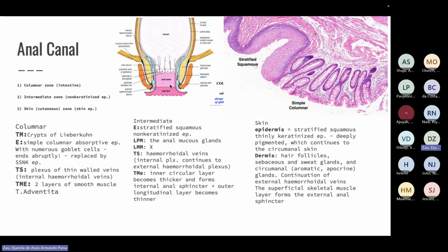So for your anal canal slide, try to imagine that they cut a section like this. And so you can see, obviously it depends on the slide, but it is very possible for you guys to see the muscle of the external sphincter, the internal sphincter, to see the hemorrhoidal plexuses, to see a little bit of the rectum or the epithelium that signifies that it's in the rectum.